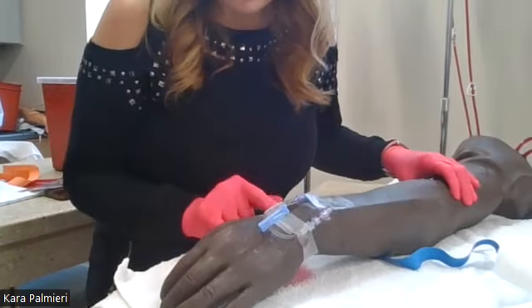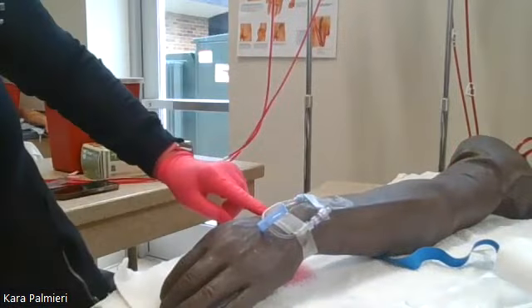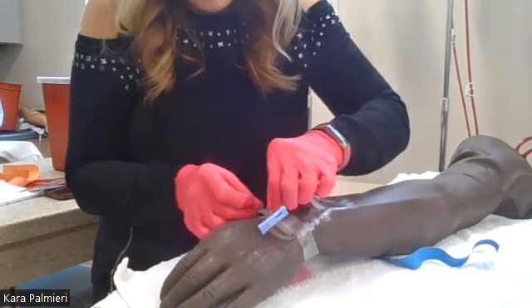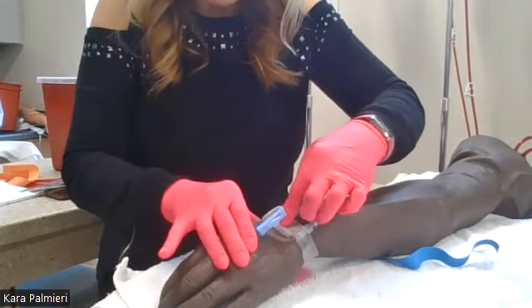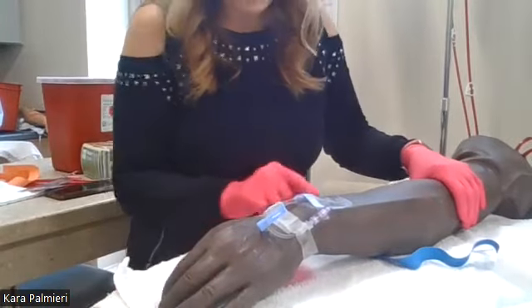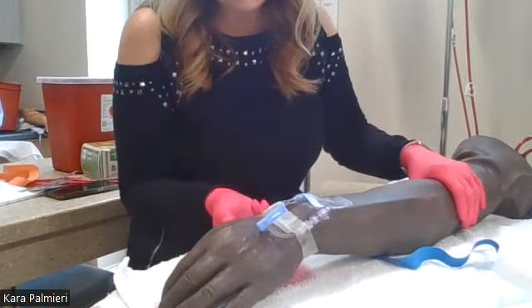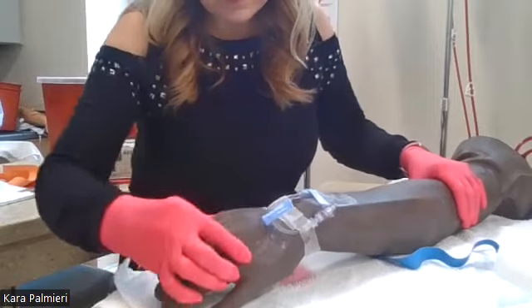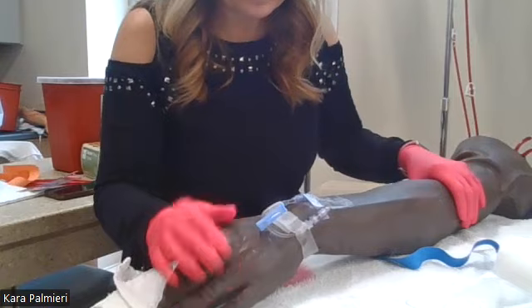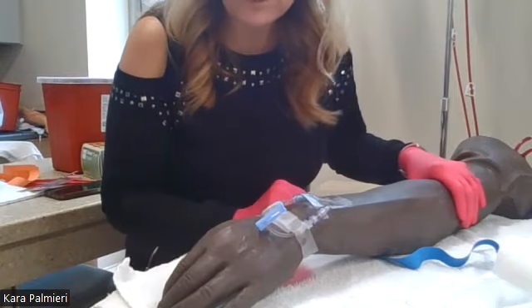I kind of want a little bit more tape on this side too, to make sure it doesn't come up. So I'm just going to go across the side to reinforce it. And my patient's happy because it's somewhere where he doesn't have to bend. It's a little bit on his wrist, the tubing is, but he should have pretty good use of his hand too. And probably didn't cause any nerve damage.